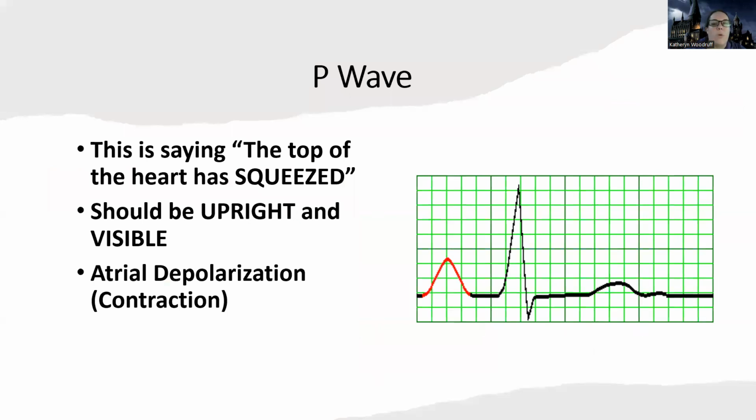Let's start trying to get into some more basics and really start to get into these rhythms. So, these parts of the EKG. Like I said, the first part of a rhythm that you're going to look for, because this is part of that systematic method, is a hill like this thing above the pointy thing. This is what I call the pointy thing. But what a P wave is, this right here, let me do a big star so that I'm not confusing you with the arrow there. Maybe I should just delete that.